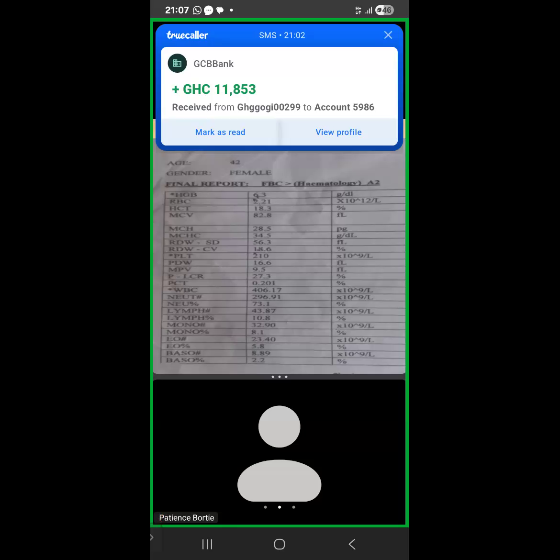There could be a problem with the bone marrow. That's why we are having a lot of retics, and the retics are not maturing to the mature RBCs. We haven't seen retics anywhere in the FBC. But I am thinking that when I look at the film.